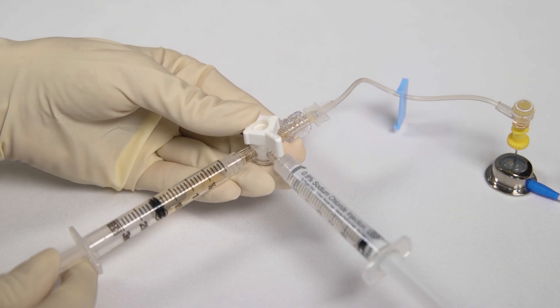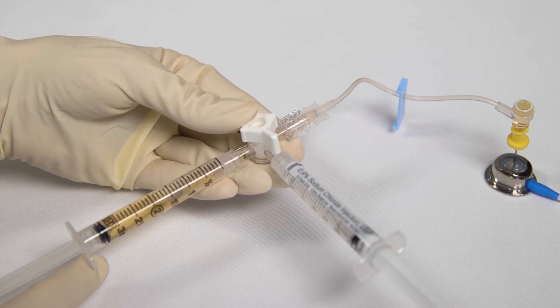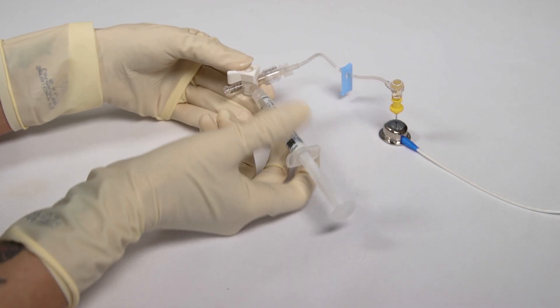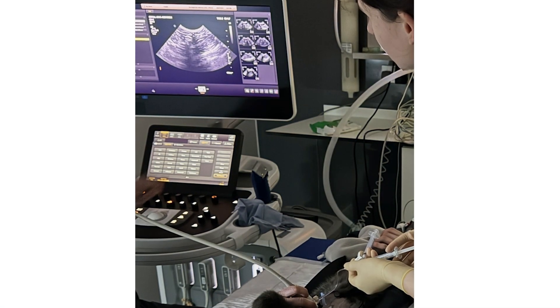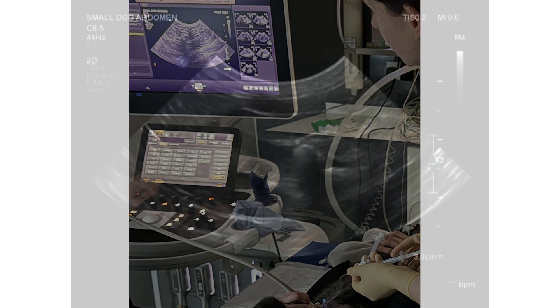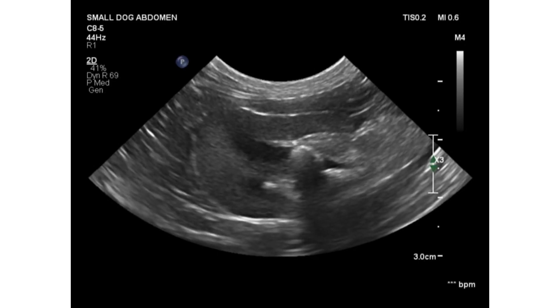A urine sample is collected from the device and submitted for urine analysis, including bacterial culture. Under ultrasound guidance, pulses of saline totalling one to two millilitres are administered through the SUB device. The renal pelvis is examined whilst the device is flushed. The pelvis should not visibly dilate. If dilation is seen, this may indicate obstruction in the SUB device.